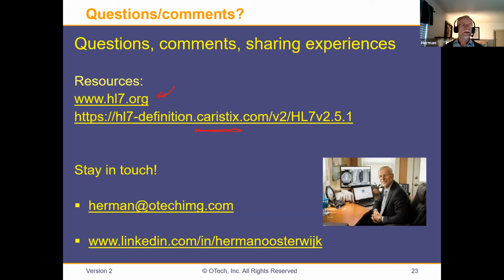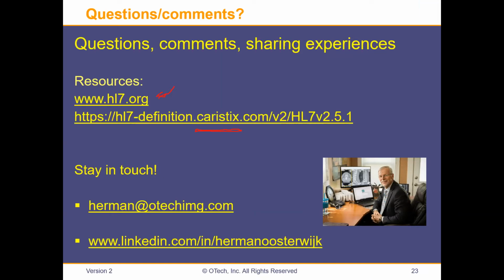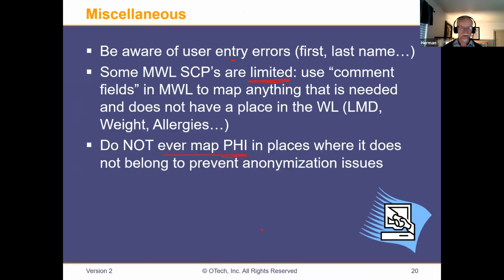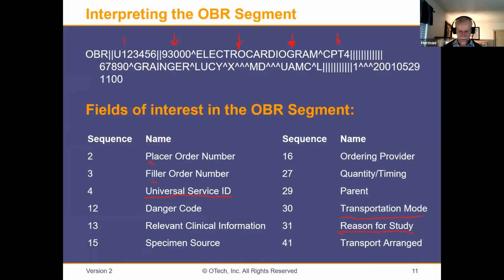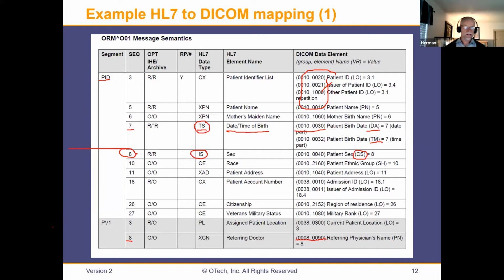Oh, so the modality worklist provider does not really create an image object, right? So basically what happens, if you look at the mapping, it takes the HL7 message on the left, so it tells you all of the attributes on the left. And on the right, there's a DICOM modality worklist query. The DICOM modality worklist query has a list of all the attributes: patient name, patient ID, patient sex, procedure code, or whatever. So all of the attributes are responses, called a query response, to my query.